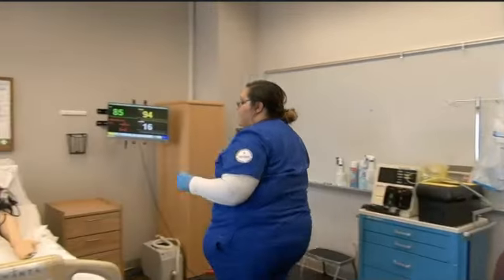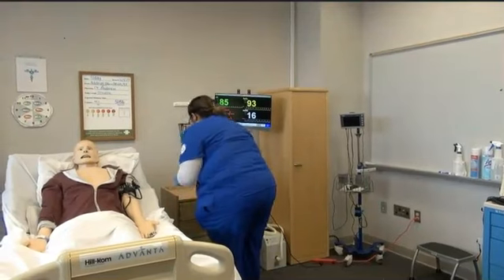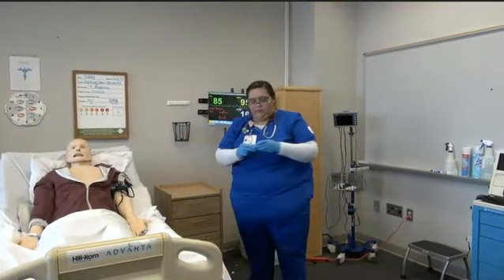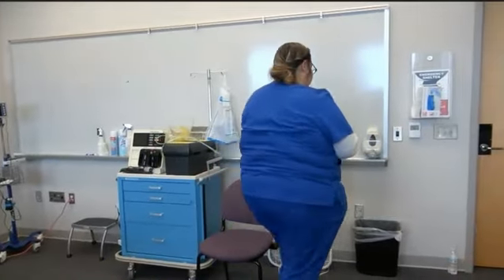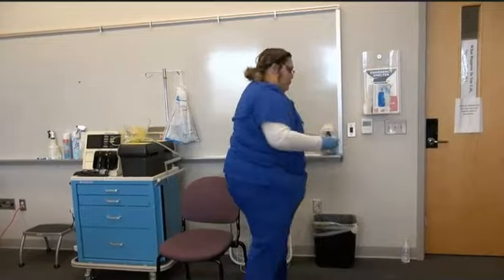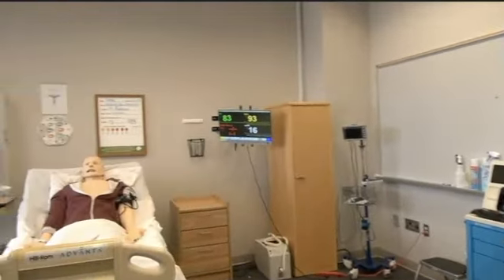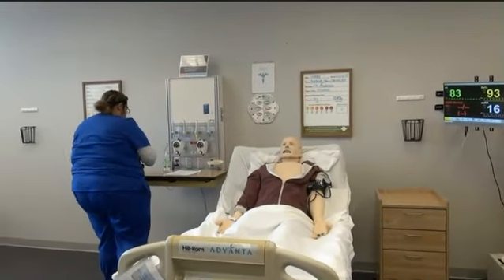I'm going to get some saline, okay, so we can rinse it out for you. Sterile saline should be used to rinse out the nebulizer. Once the sterile saline has rinsed the nebulizer and has been emptied out, the nebulizer should be placed for air drying.